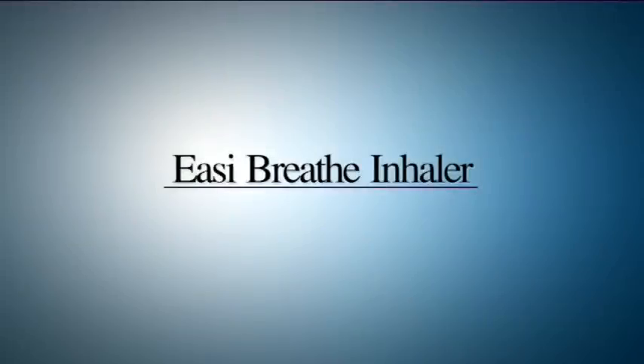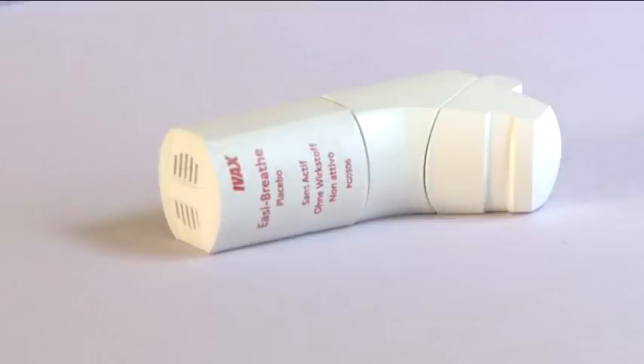The Easy Breathe CFC Free Inhaler is designed to make it easier for you to use. It is a breath-operated inhaler. This means it only releases a dose when you breathe in.